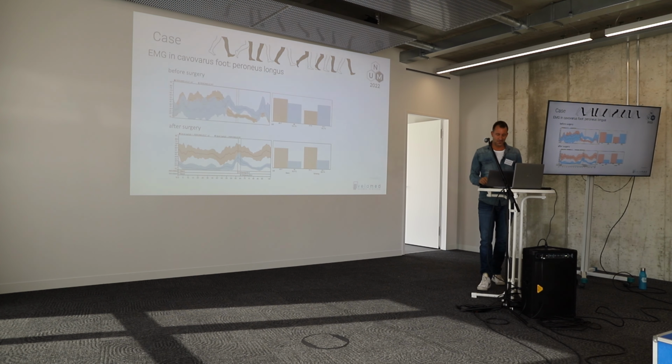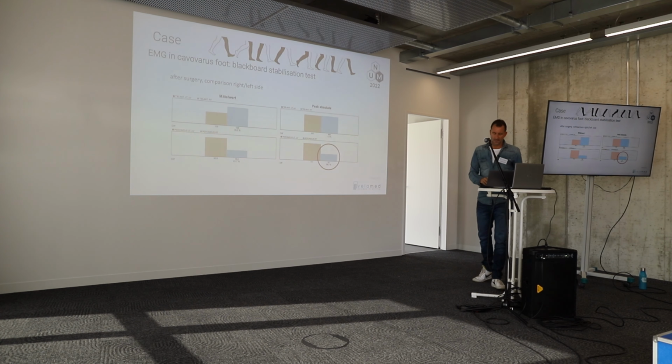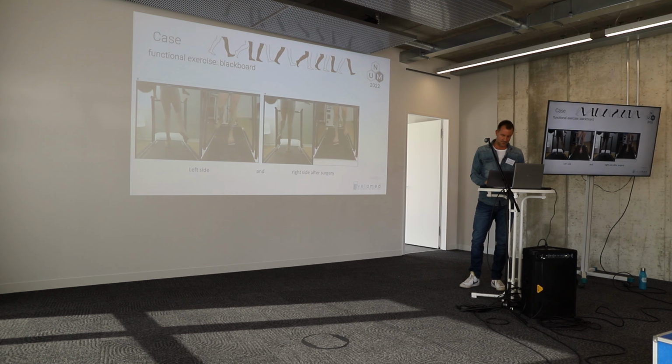Yeah, it was. Because 1 year after trauma, and you can also see it here in the blackboard test, 1 year after trauma, he had no supination trauma at all, and subjectively he feels totally stable. Why is it like this? To objectify this, one moment. Here is the blackboard exercise. That is the left side after the operation, the non-operated side.